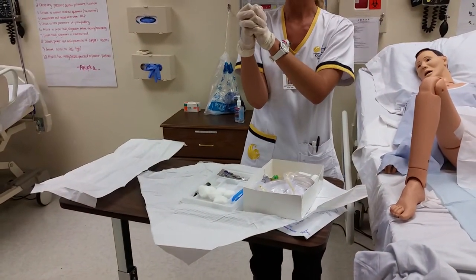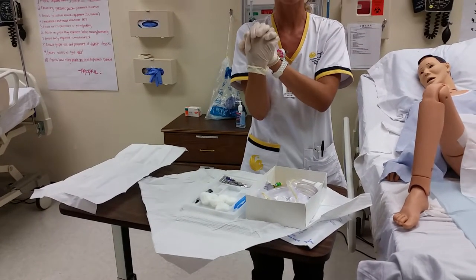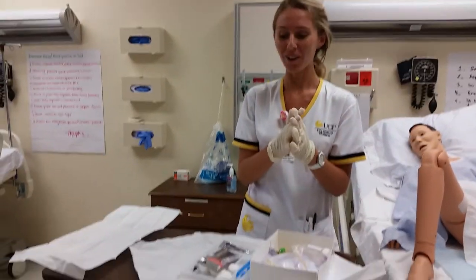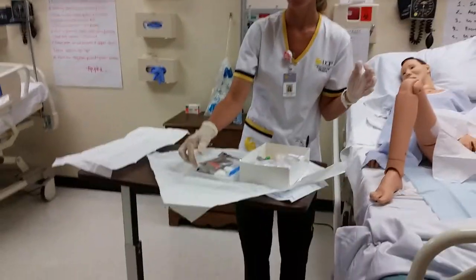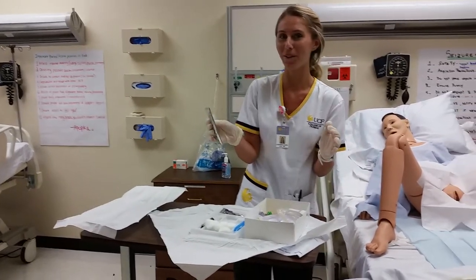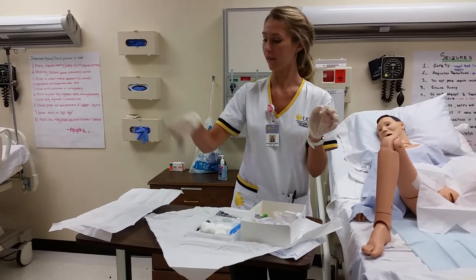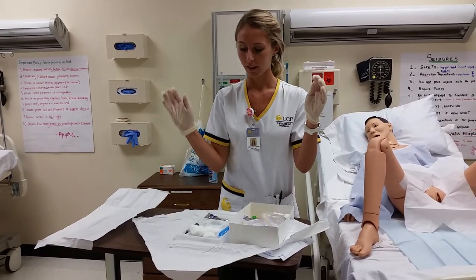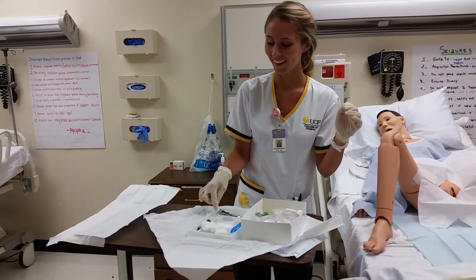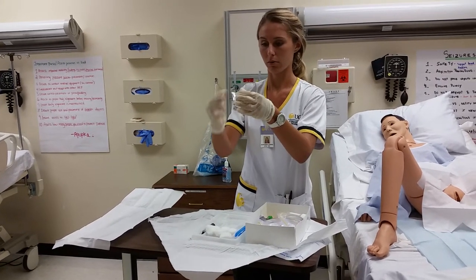And I don't have any chlorhexidine in here, so we're going to pause this and go get some. It's still recording. Well, my nursing assistant personnel was able to get me some extra chlorhexidine. So I'm going to go ahead and open this, pour that on there. And you're awesome, Miss Hoyt. I'm going to go ahead and open my loop.